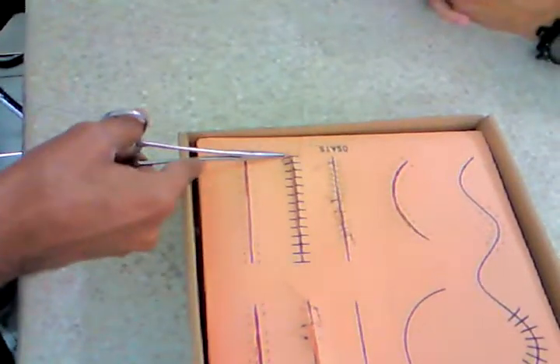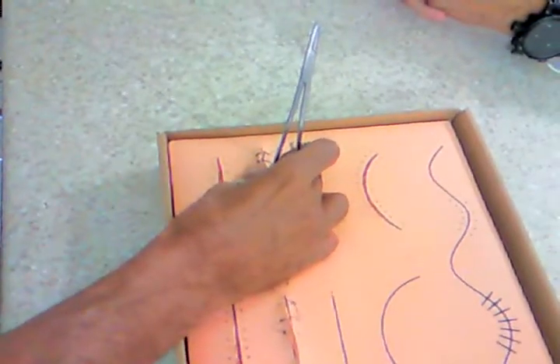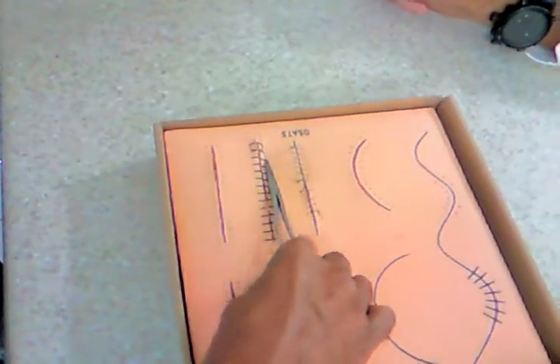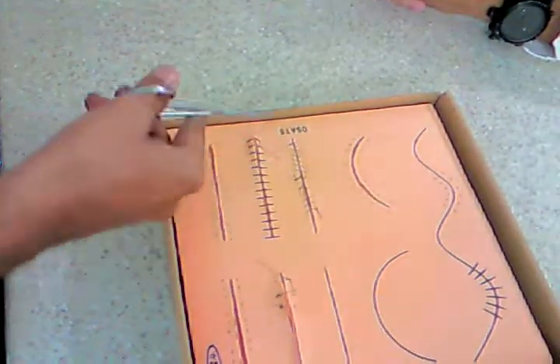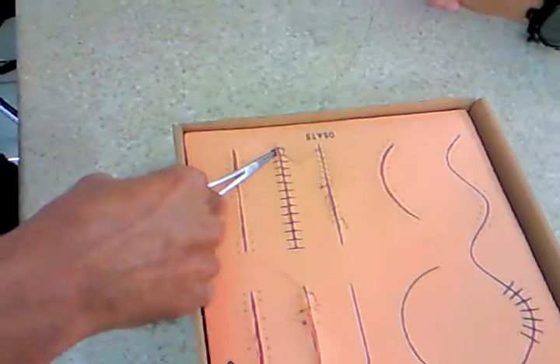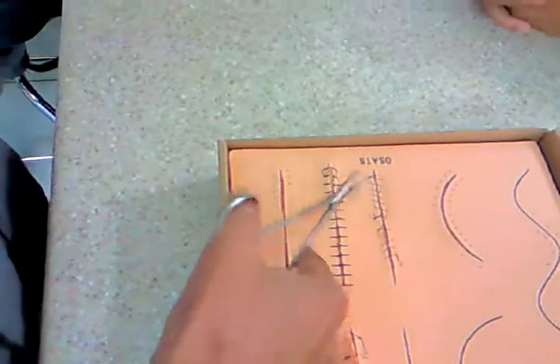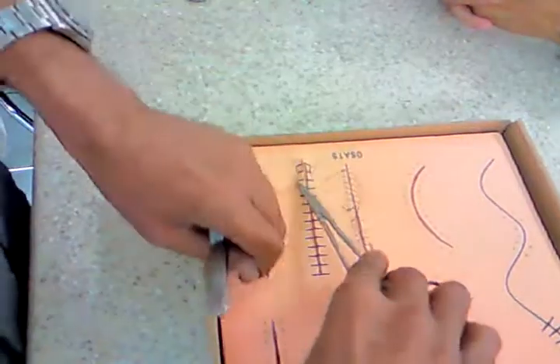You see, it came like this, just to make sure I'm not wasting too much material. Tie it off. Can you see? This way, this way, this way, this way. And you can see the edges got everted. This is used for scrotal skin where there's a dartos and for necks where there is platysma. And then tie it off as usual, a few throws.